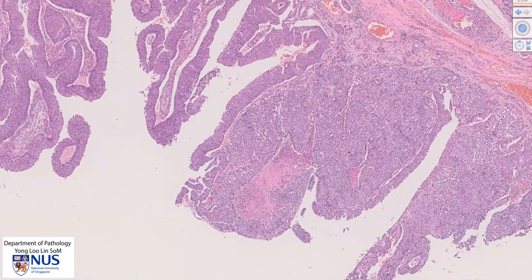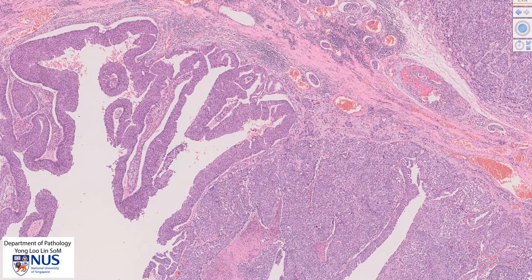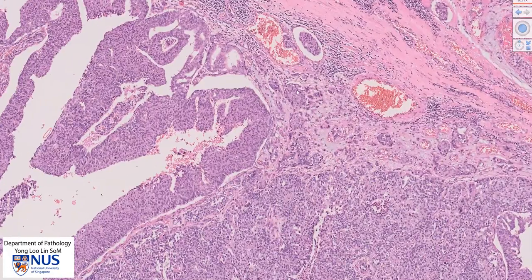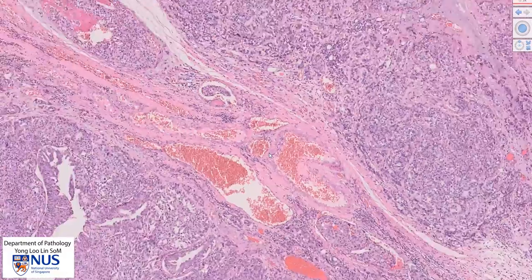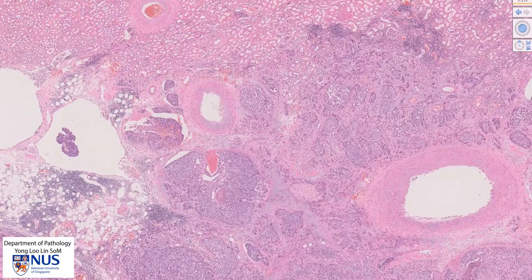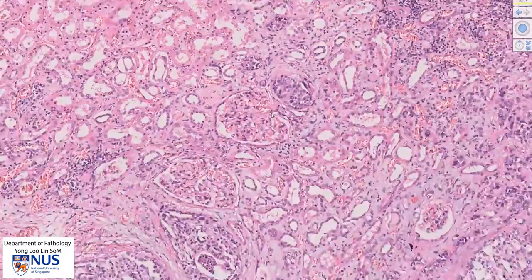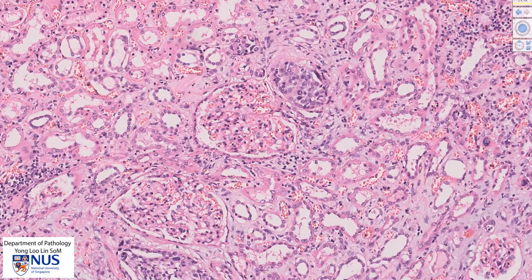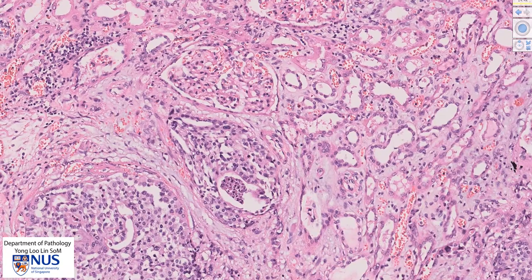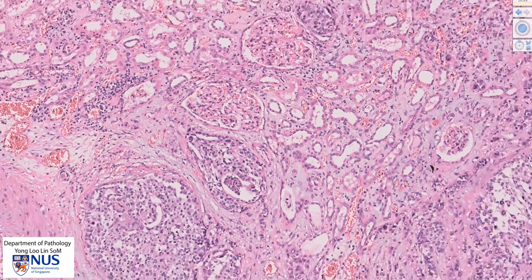However, in this particular case, we can also see another feature, which is these large sheets of malignant cells that are infiltrating into the underlying stroma. And in fact, over here we can see that they are infiltrating into the kidney itself. Here is a nest of malignant cells sitting right beside a glomerulus, and here is another sheet of malignant urothelial cells sitting beside a glomerular structure.